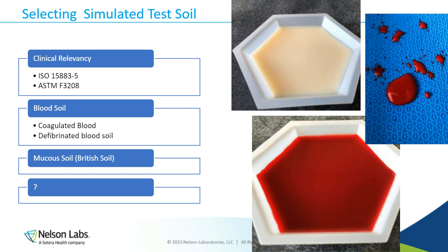What is left on the device after the procedure is done, right? And that's the important part that you have to figure out. For example, cauterizing devices, robotic devices that go in where there is electrical energy, the blood is cauterized on the end of the bipolar forceps. That has to be mimicked in a laboratory environment, and then you have to subject that to the validation. So we are starting to see movement towards more surgery type of simulated use test soils than what was historically used.